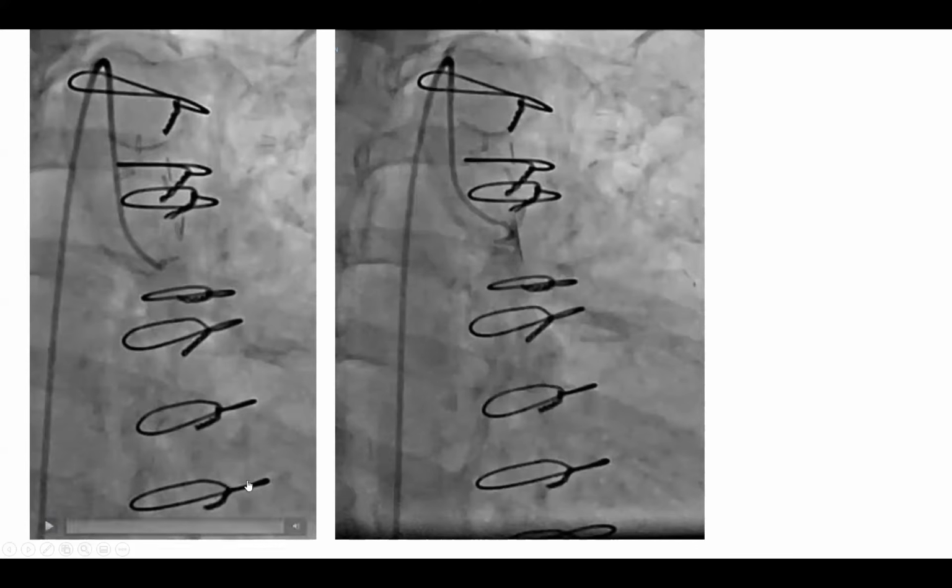Or better yet, do an aortogram in two views, in an RAO and LAO view. So you need to pick the better view to do your aortogram to see where that graft is, or to see if that graft exists, is open, but you missed it.